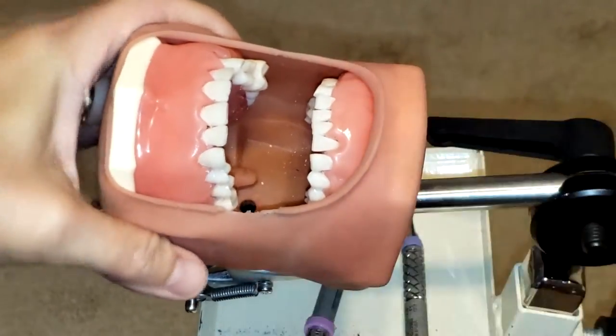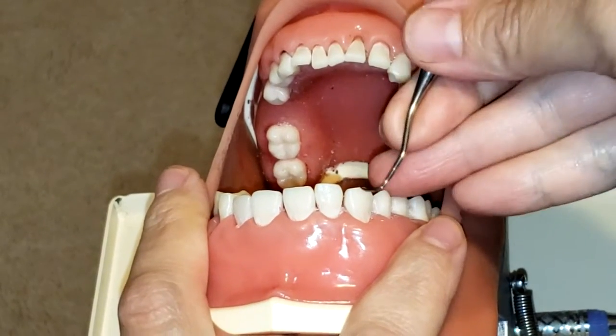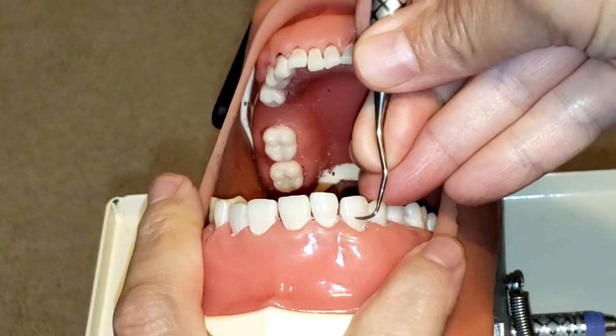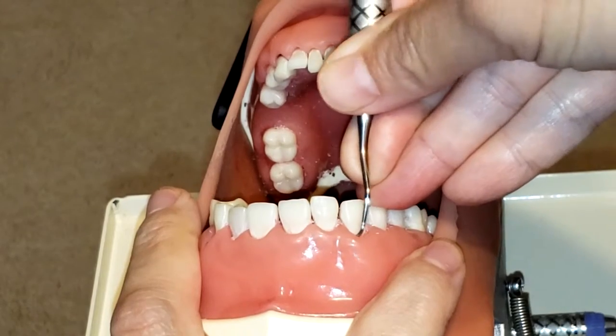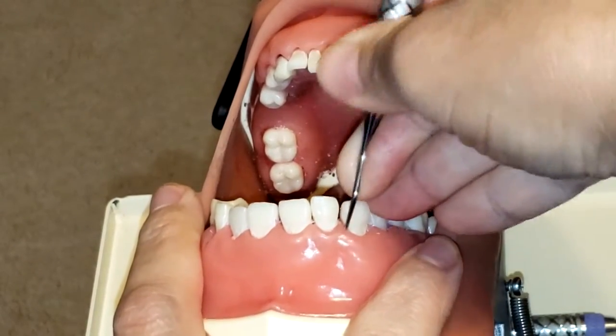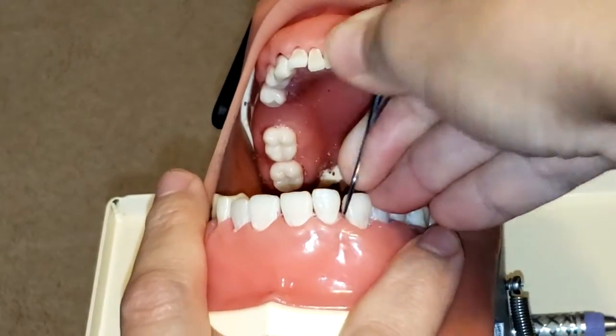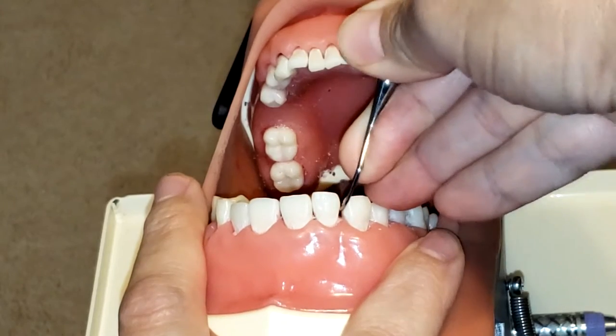Now we're going to do surfaces away. I locate my cutting edge, start at the midline, and begin to activate with a 70 to 80-degree angulation for calculus removal, going all the way into the proximal.